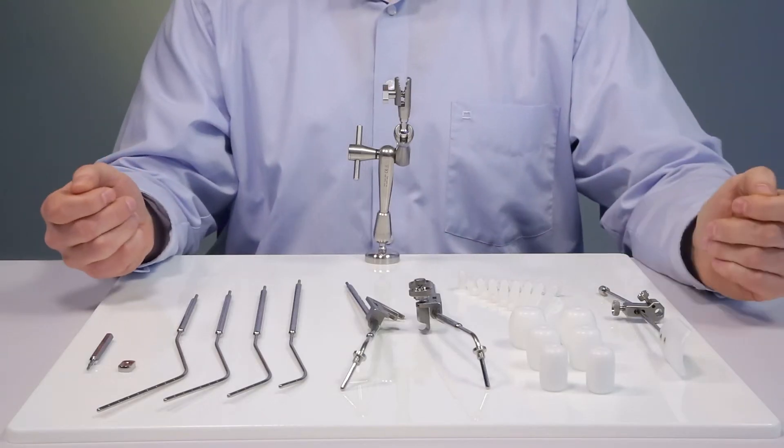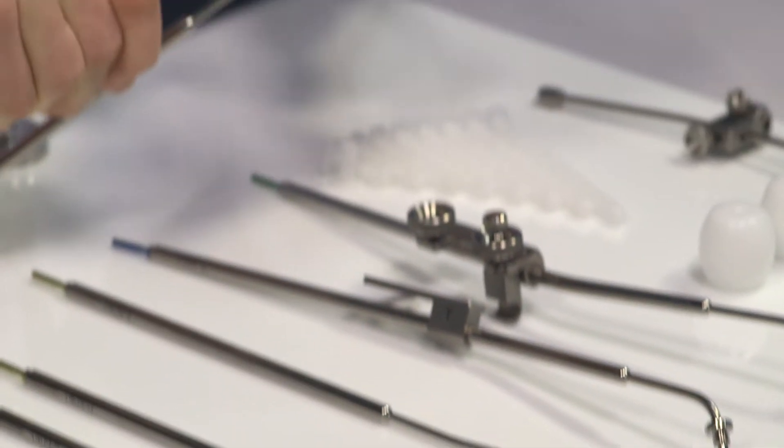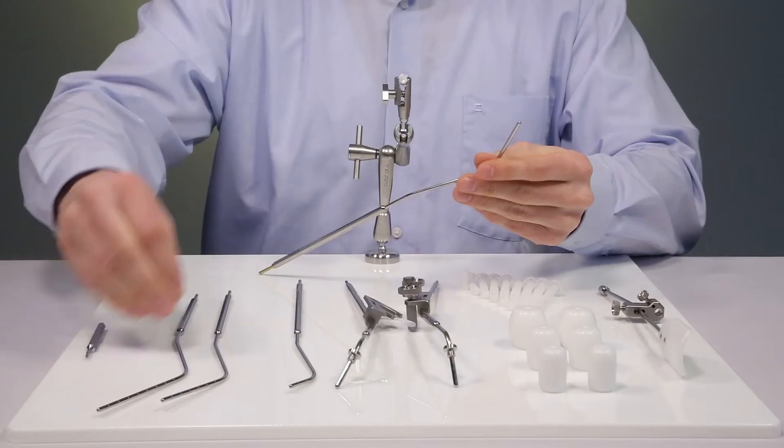Now let's start with the assembly. I select an IU tube and fix the cervical stop.